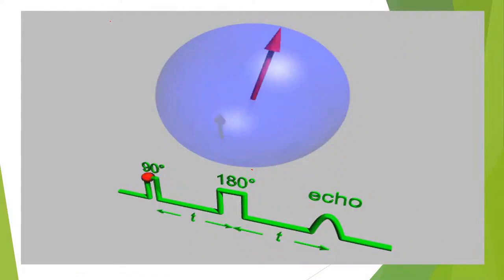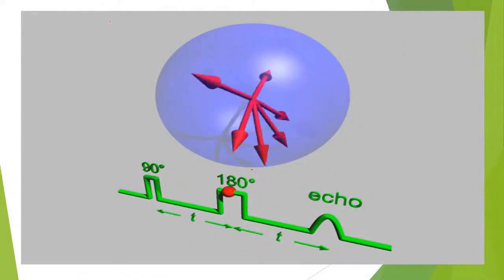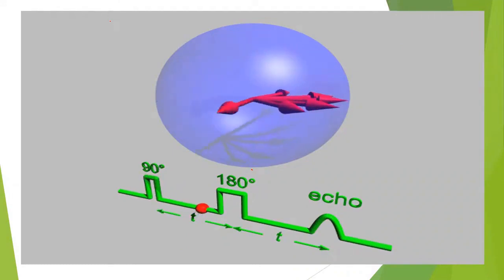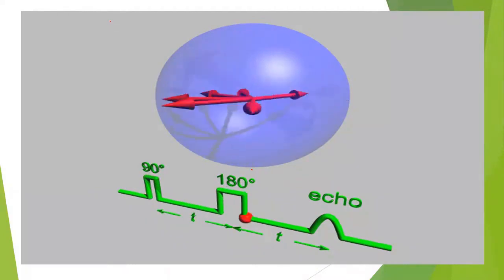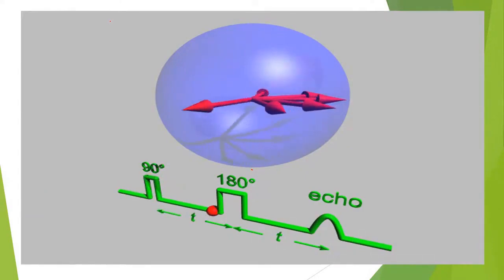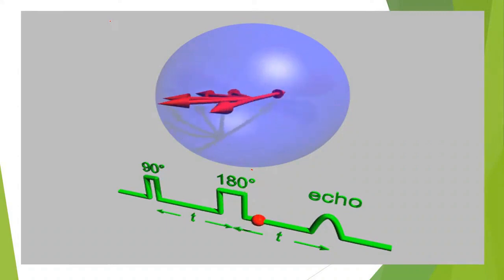When the 180-degree refocusing pulse is applied, it flips the protons, meaning they return in the opposite direction. They start to gather as soon as they reach the maximum gathering point, which is where your signal begins to be collected. Once they reach the maximum point, which is the highest magnetic strength, your signal starts to be recorded. From 90 to 180 degrees is half of the echo time.